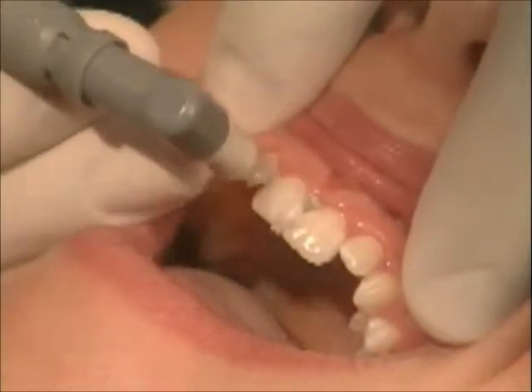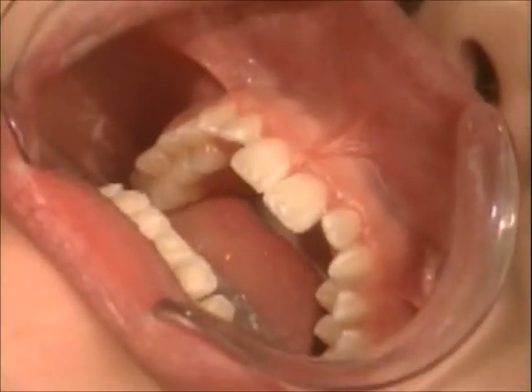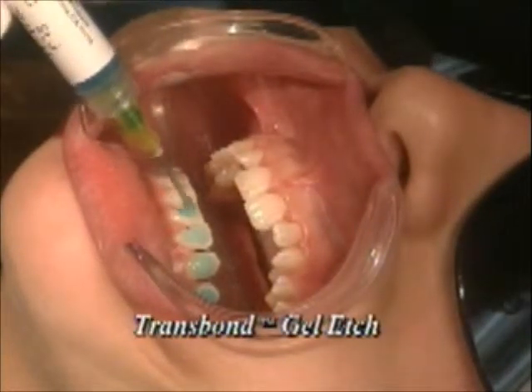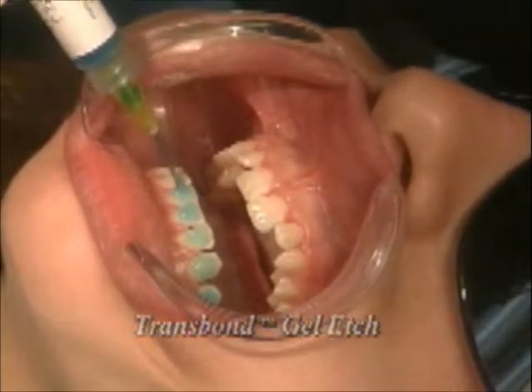The teeth must be cleaned, isolated, and etched. Apply Transbond Gel Etch to the lower arch. Time according to the manufacturer's directions.